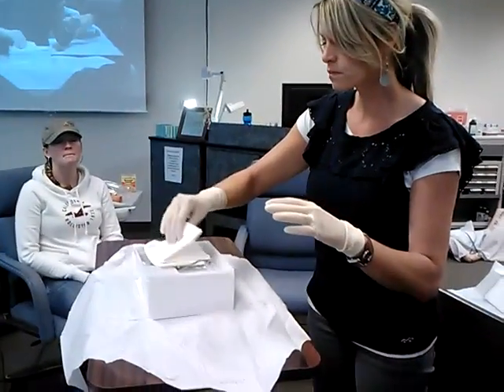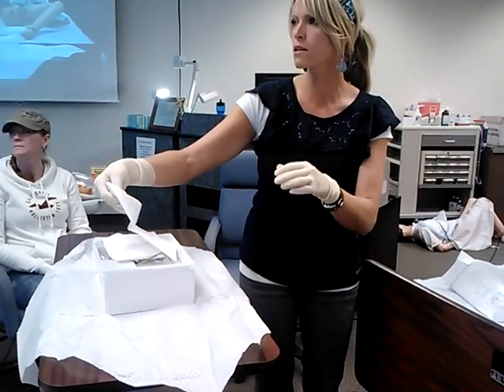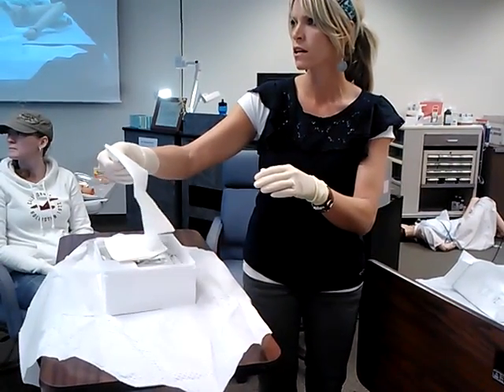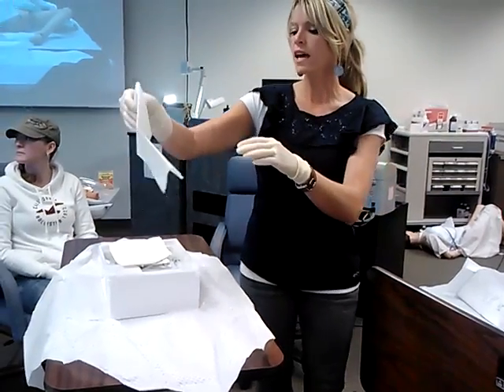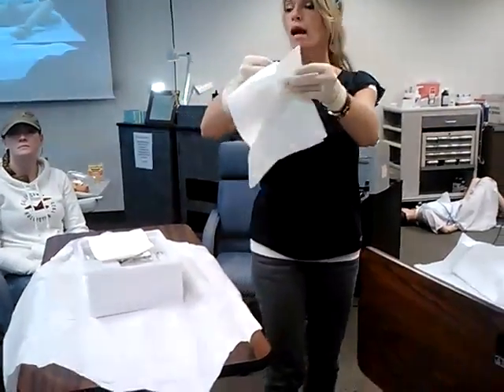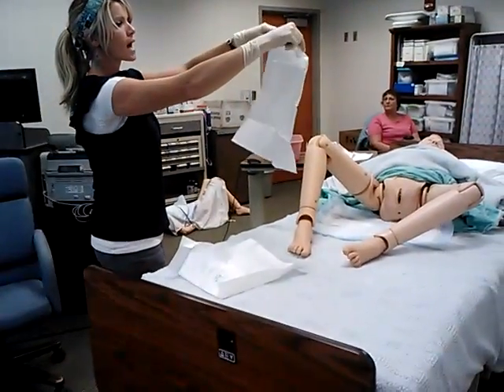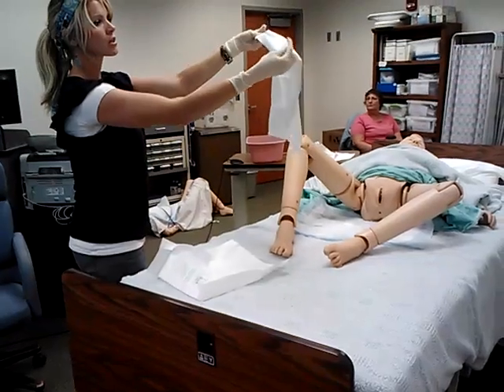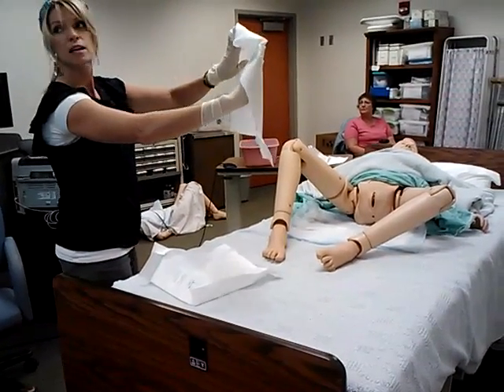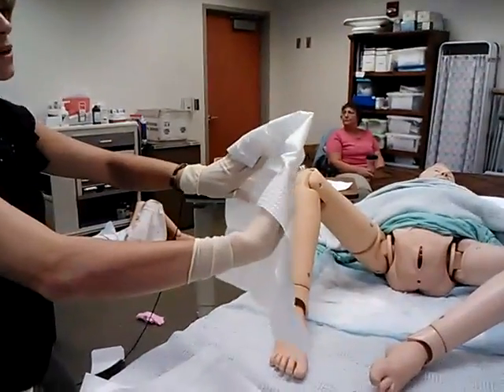Now, this is so hard because I'll just show both. Can you guys still see the patient in Richfield if I do this? Yes? Okay, the next thing is the drape. This is a sterile drape. So you take your sterile drape. You wrap the corners up in your gloves like this. Like this. So you roll it up kind of like this.